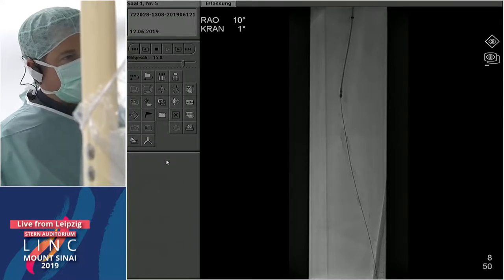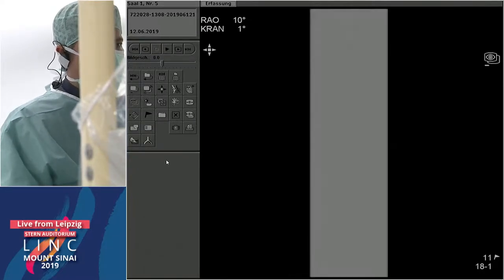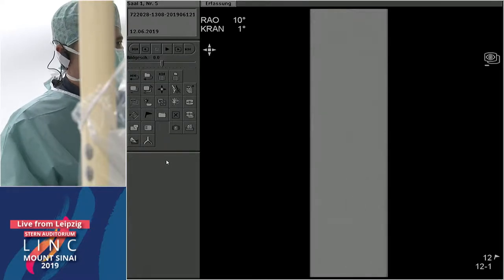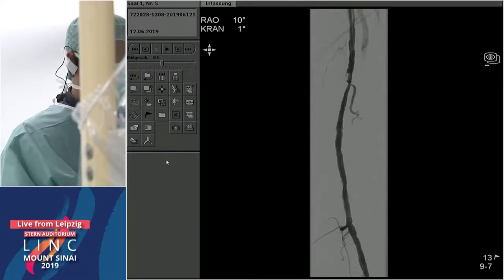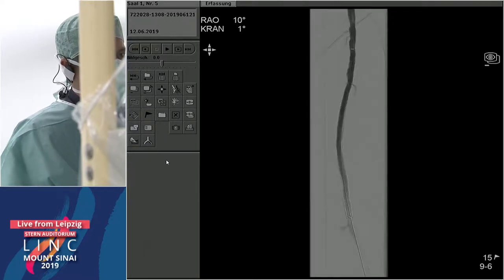One more pass. The distal area with calcium was where the subtotal stenosis was — I could not push the Rotarex across. I then did PTA with a 5mm balloon. There was still some soft material. Proximal appeared to be thrombus, so one more pass with the Rotarex. Then we decided to put in a stent: one 6×20 Illuvia stent, plus an additional stent proximally which only fit after pre-ballooning. The result after these two stents looks good.